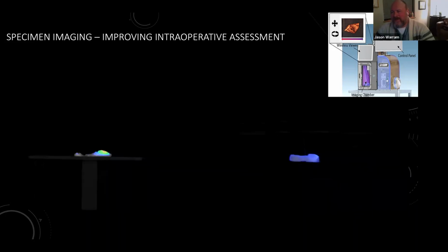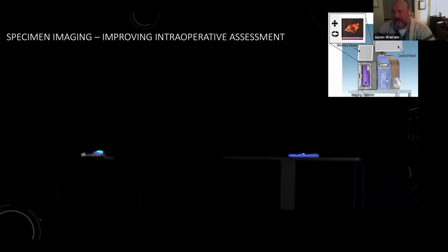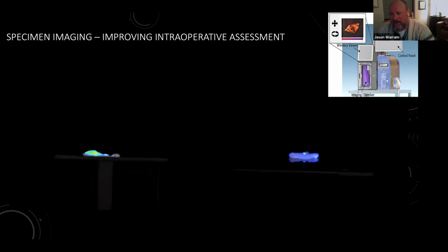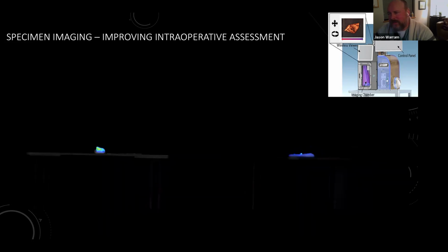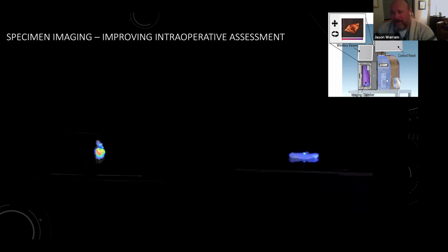I think because we're in the optical range, we're always going to be limited. That's why, particularly here in the head and neck cancer world, where head and neck cancer has the highest number of intraoperative assessments per case than any other tumor type, and in those cases, as you know, the margins that are sent for intraoperative assessment are very small, very thin. They do that in order to load the entire tissue on the chuck and then be able to section into it. But if you get anything bigger than a half a centimeter to a centimeter, we're always going to be limited.